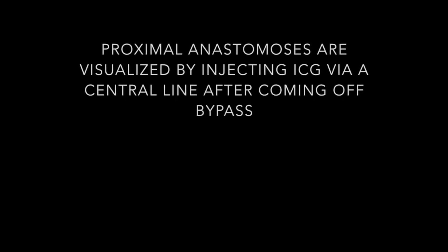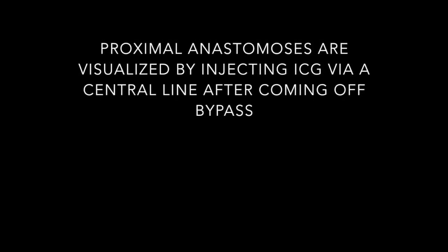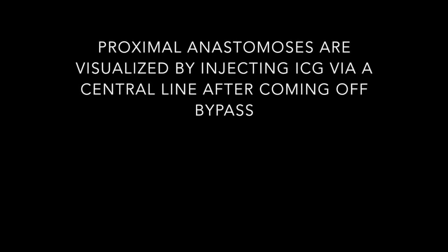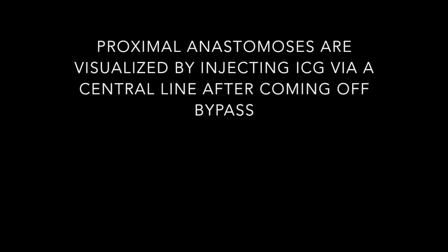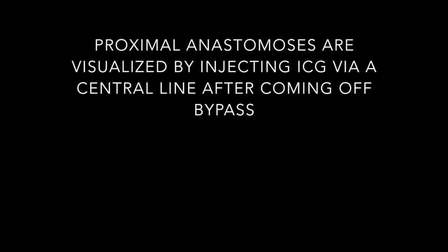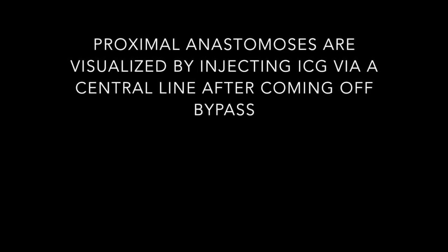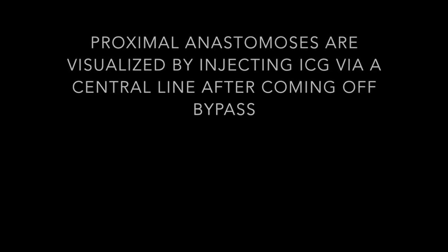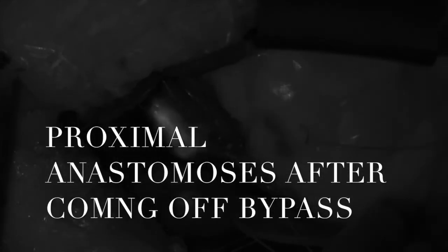We visualize the proximal anastomosis by injecting 1 cc of undiluted contrast through a central line and flushing with 10 cc of sterile saline. These images take 20 to 30 seconds to materialize and allow us to ensure that all bypass grafts are patent at the conclusion of the procedure. The contrast can be followed through the right heart, the left heart, and onto the ascending aorta. All grafts should illuminate together. We have found intraoperative fluorescent imaging a quick and easy method to ensure the integrity of our bypass grafts.